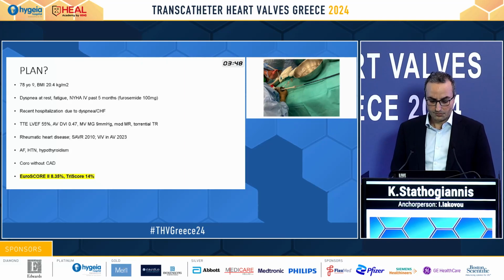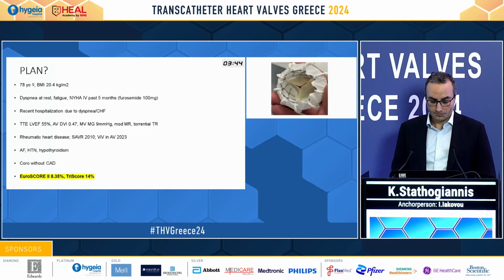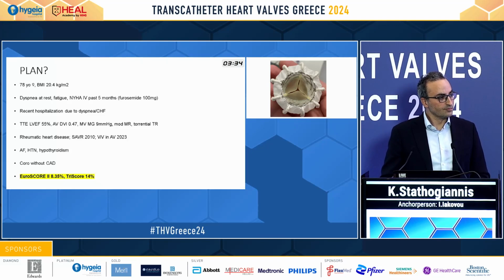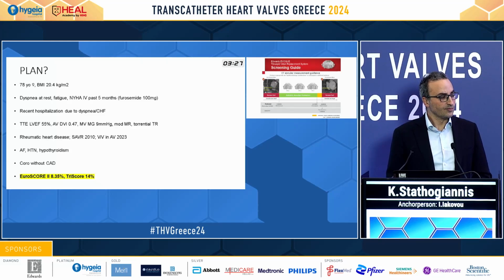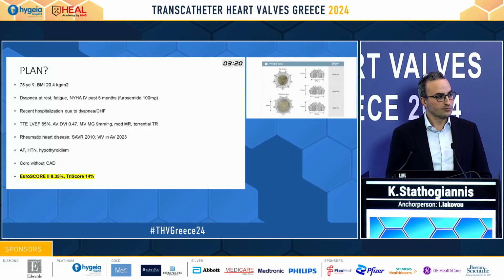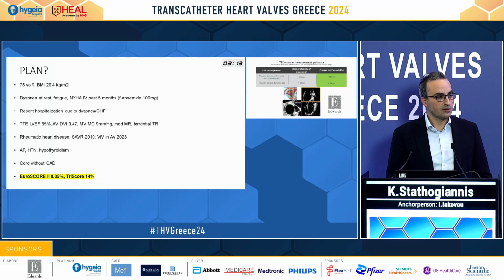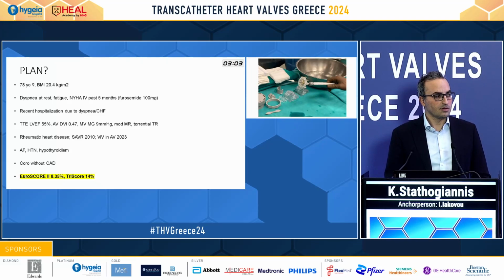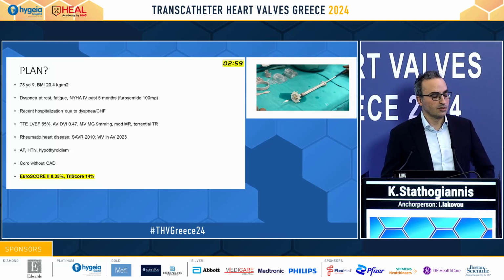And why not one of the TMVRs that hopefully are coming soon, like the M3? Good. So in hindsight, the heart team, one year before, maybe should investigate the possibility of a reduced surgical multivalvular approach more thoroughly, Michali. To be a high risk for, but I agree with you. In hindsight, at the point of possible redo, but it would be a redo aortic valve replacement. Yeah. So it would be very difficult. Very difficult, and one has to do what one has to do, right? So maybe we cannot do everything. So how did you proceed?